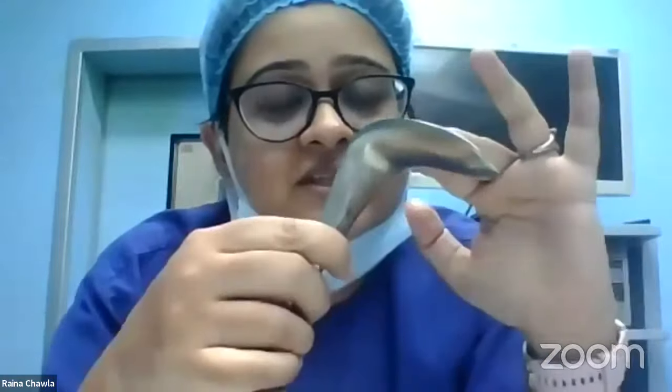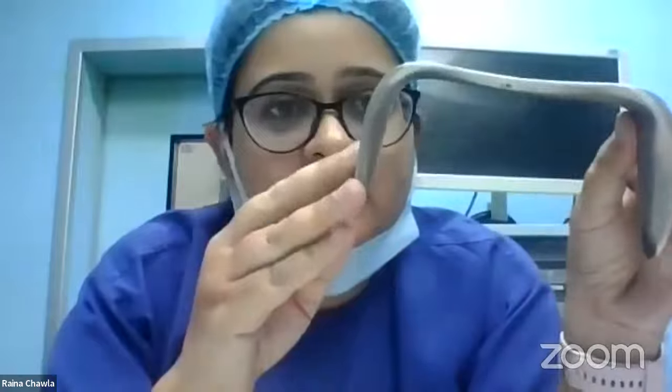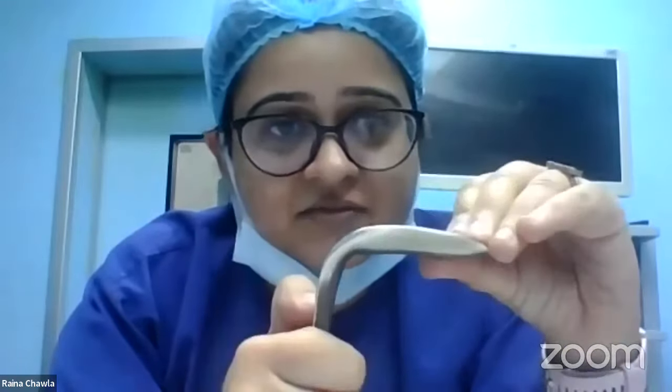The Sims speculum. You can see it has two blades, one on top and one at the bottom, and there's a groove in the middle. Now, the Sims speculum has many purposes. Basically it is used to diagnose, or to visualize the vagina and to visualize the cervix.